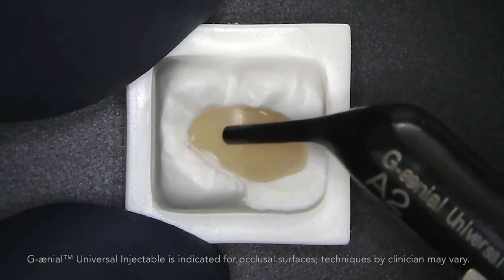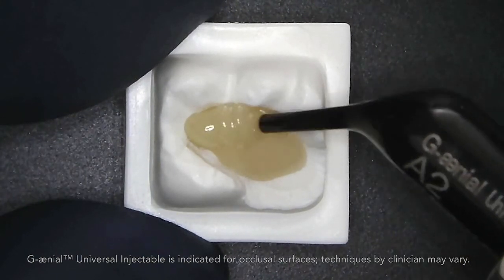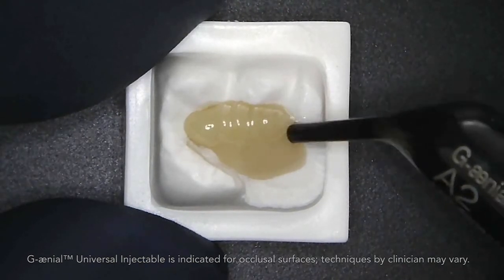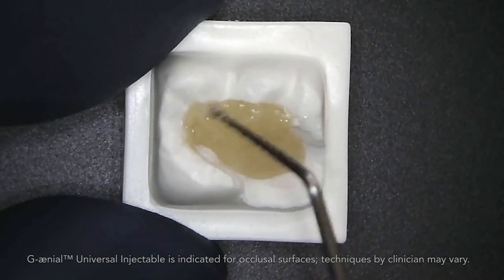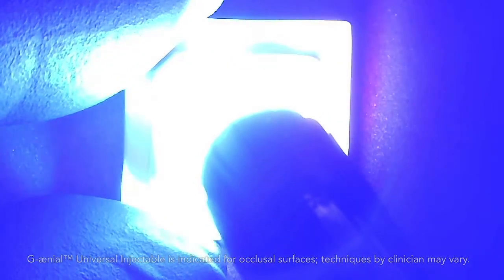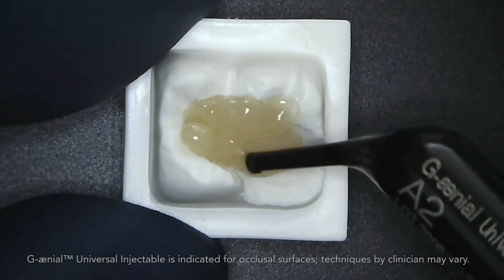A great way to manage this in creating a final restoration is to build up over the Everex Flow substructure with the Geneal Universal Injectable. Dispensing from the unit tip dispenser, we can build up one side and shape the cusps. Light cure — just a few seconds for demonstration, but typically a 20-second cure is recommended. Then we build up the remainder of the tooth.